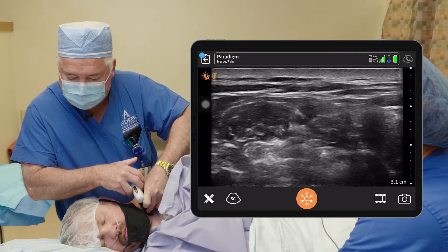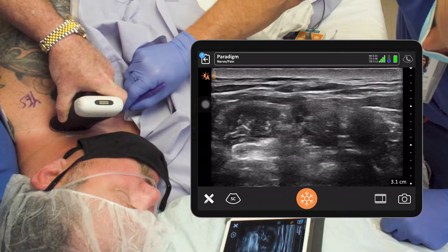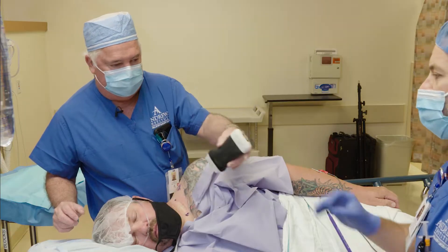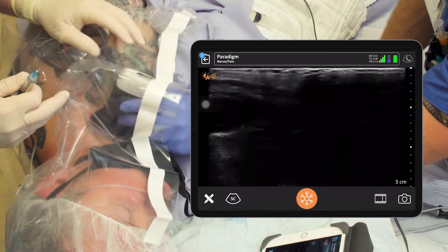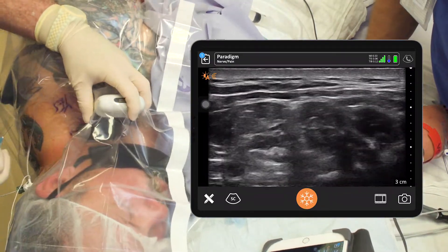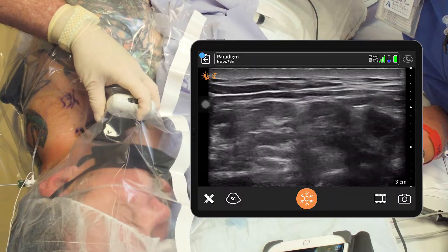He's a tough one. Right there, you can kind of see it right there. We'll kind of mark our probe so we know where we're coming in. Then we're going to prep and drape posteriorly here. Rocky, my block nurse, is going to hand me the probe. He's got it right back where we had it marked before. I still got the probe — it's easy to hold. I'm on the sterile side; the probe's over there with Rocky on the non-sterile side.